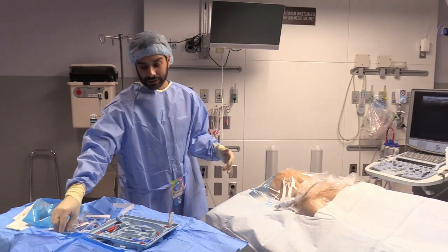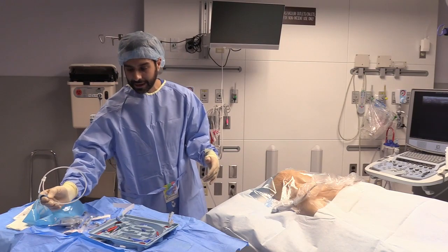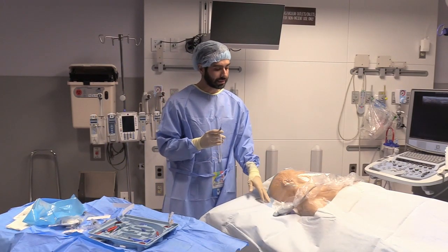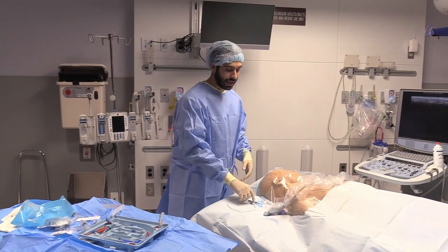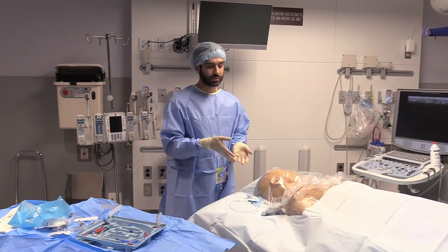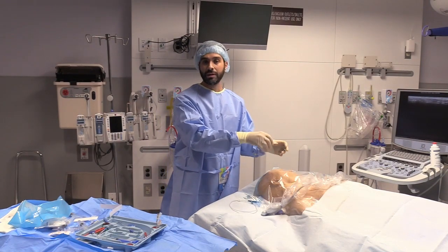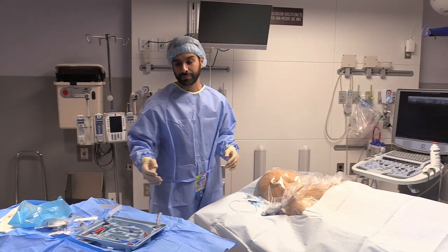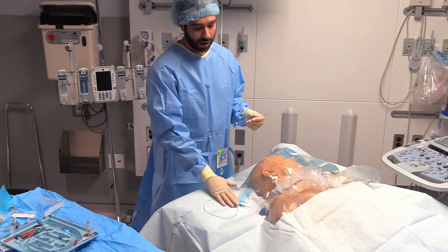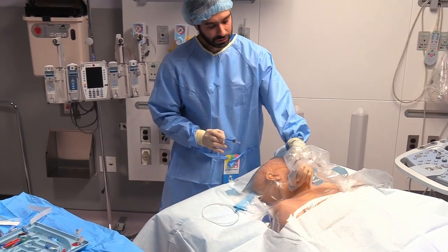Then once I'm ready to actually gain access to the vein, and I think this is where a lot of the skills of placing an ultrasound come in. I like to have my wire very close to me, so I actually will put it here. Some people don't like to put anything on the bed. I like to have the wire close so that once I reach the transition from the needle to the wire is very simple. And now I'm going to have my needle, I'm going to have my wire next to me, and I'm going to put the ultrasound directly in front.